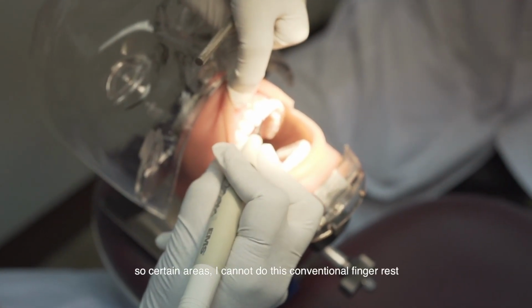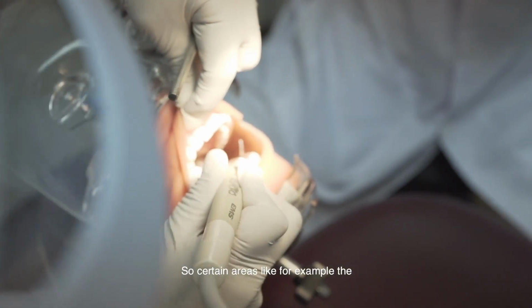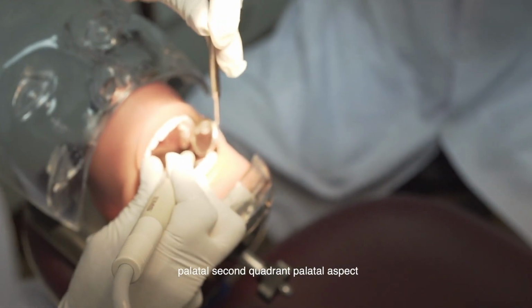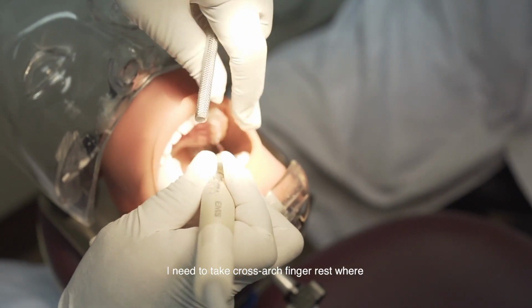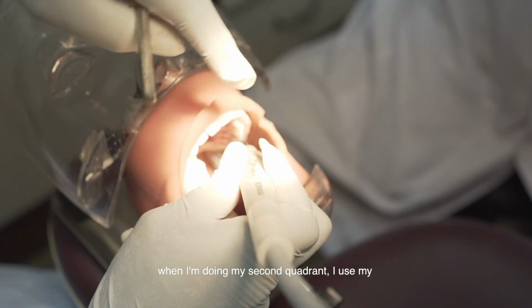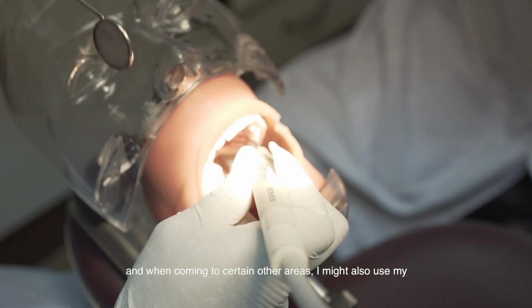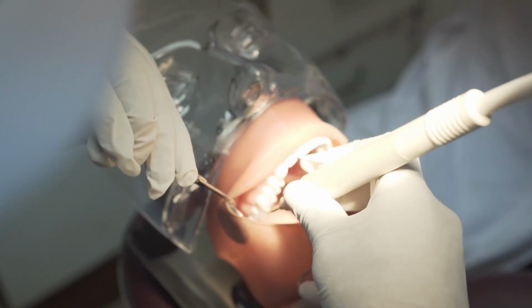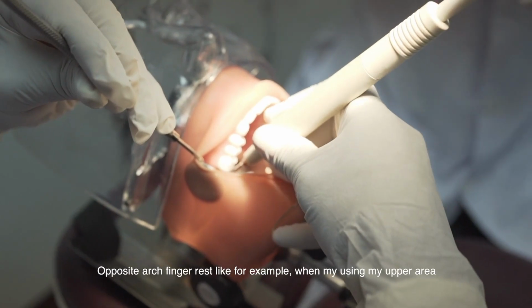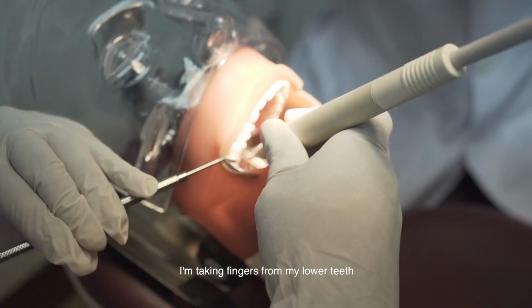In certain areas I cannot use this conventional finger rest. For example, in the palatal aspect of the second quadrant, I need to take a cross arch finger rest, where when I am doing my second quadrant, I use my first quadrant as my finger rest area. In certain other areas, I might also use an opposite arch finger rest. For example, when I am working on my upper area, I take finger rest from my lower teeth.